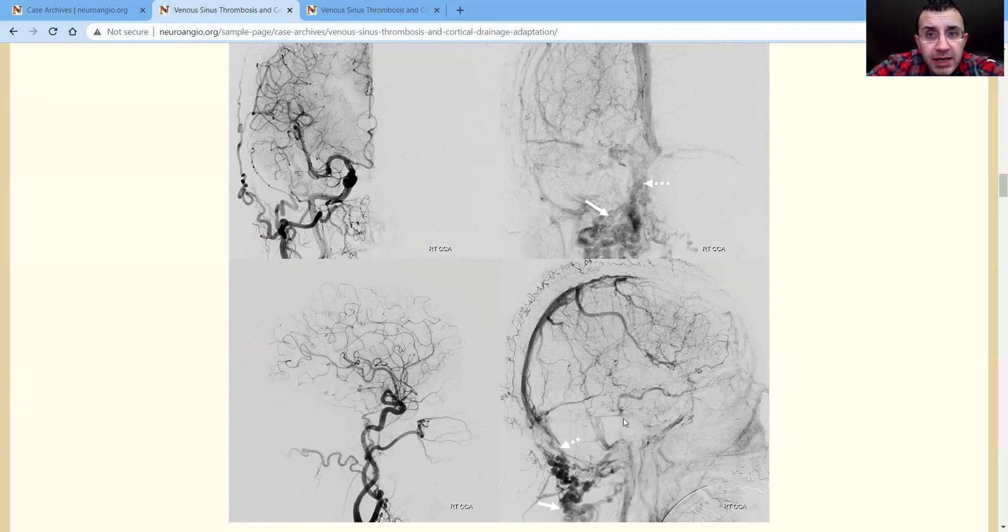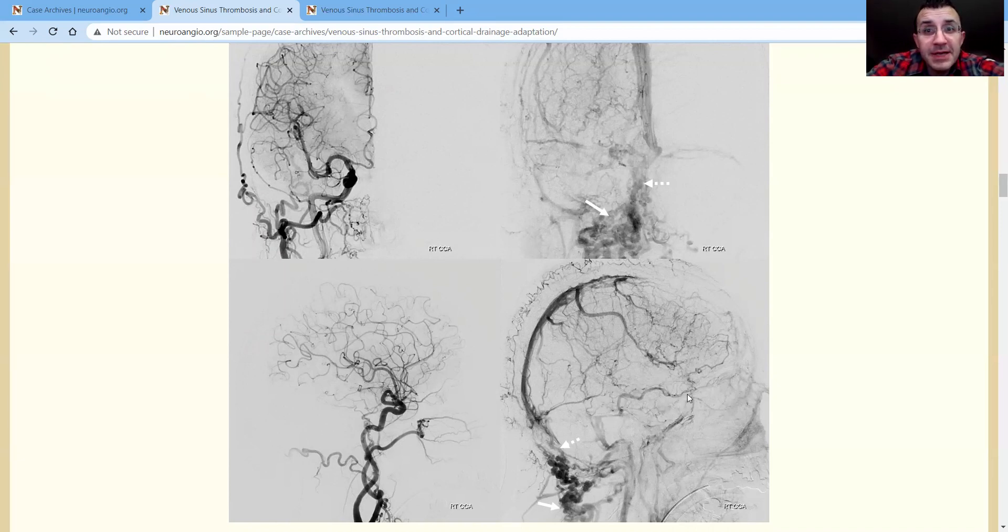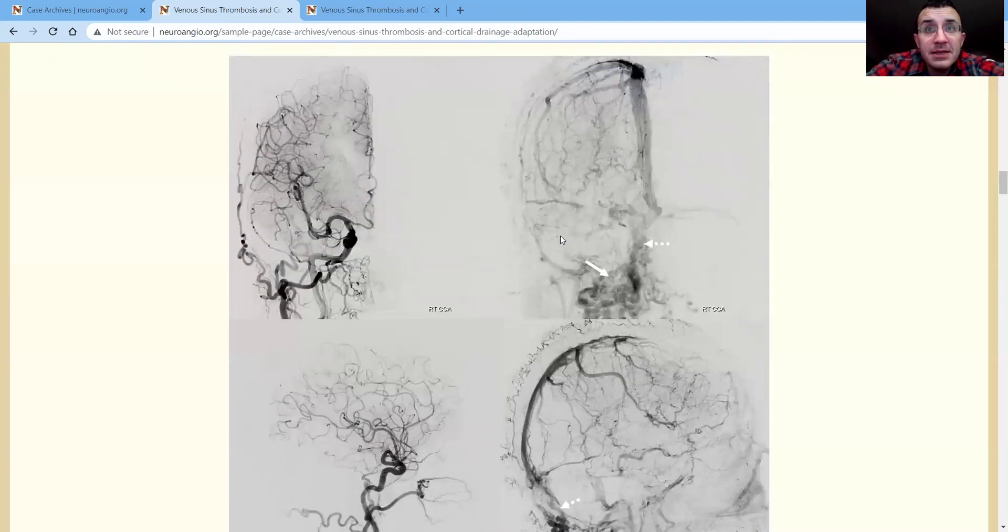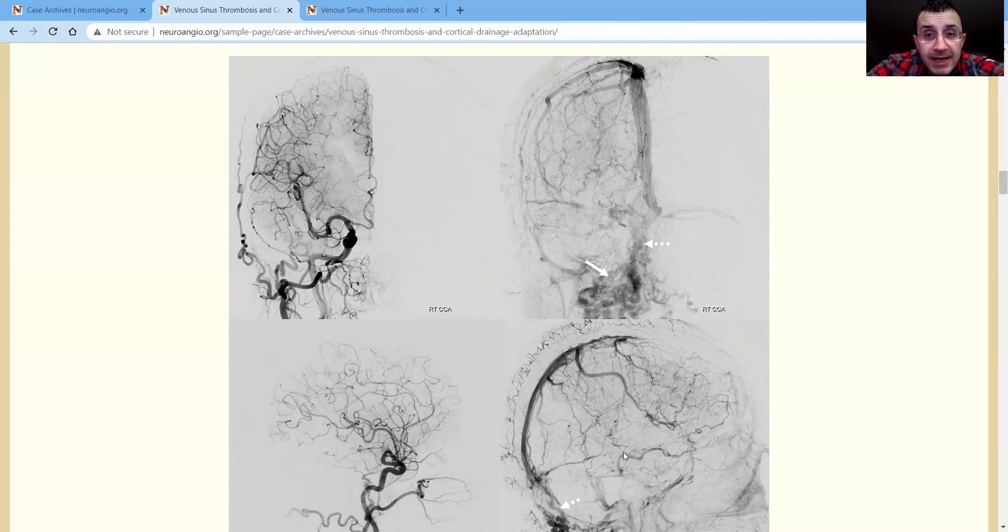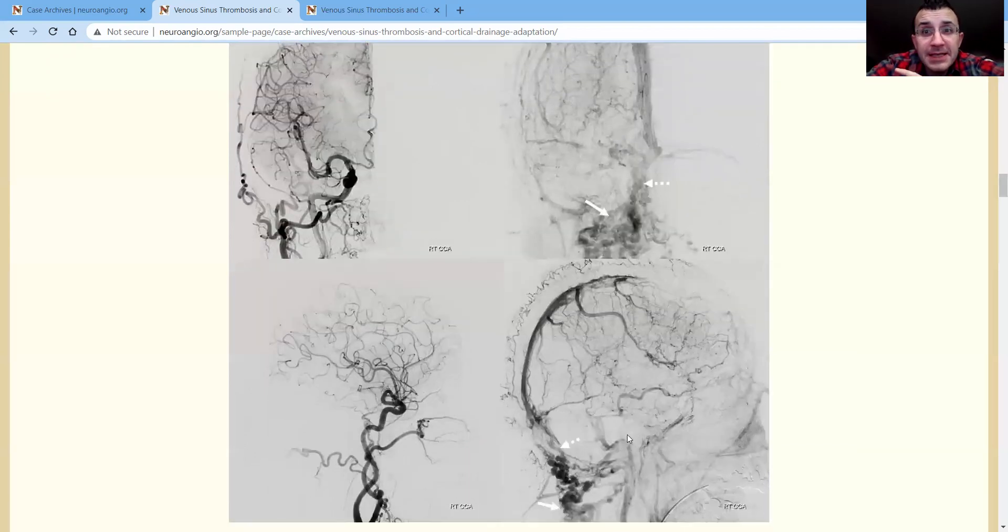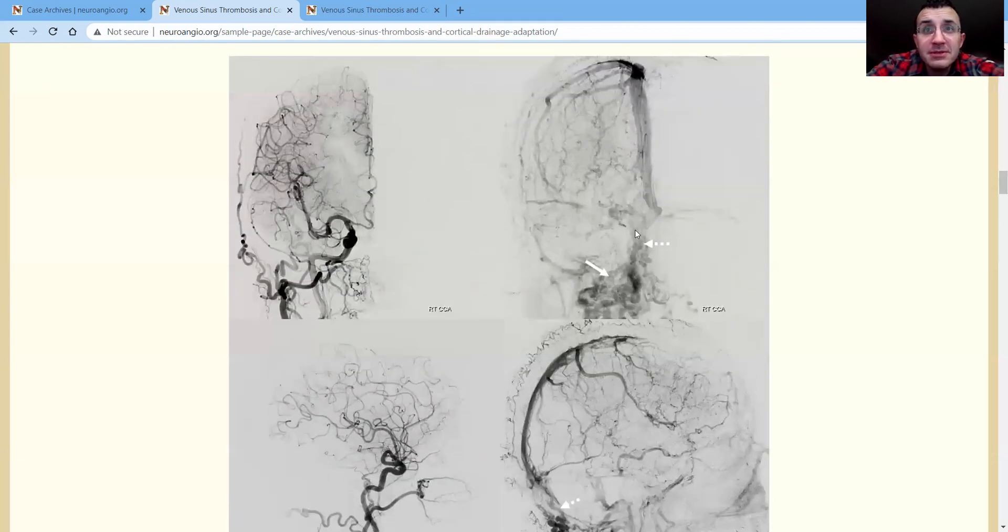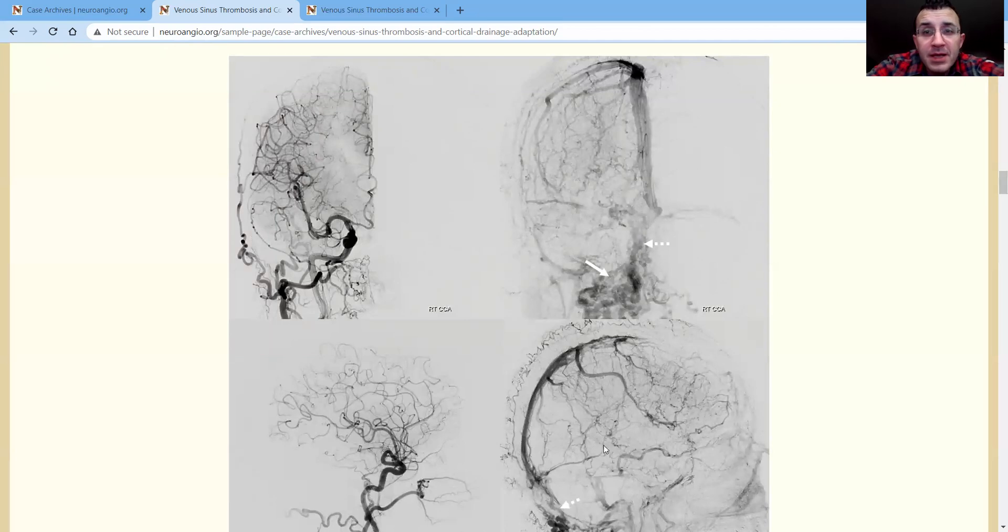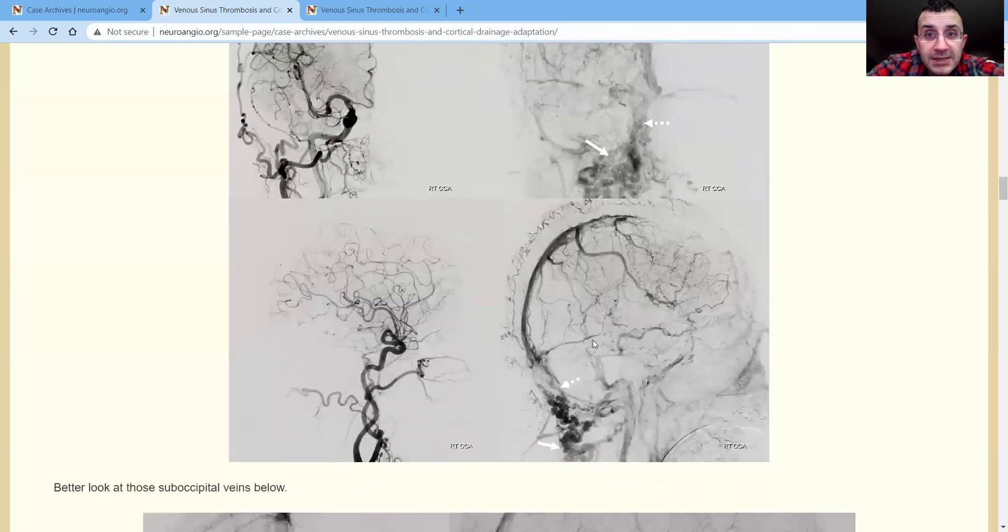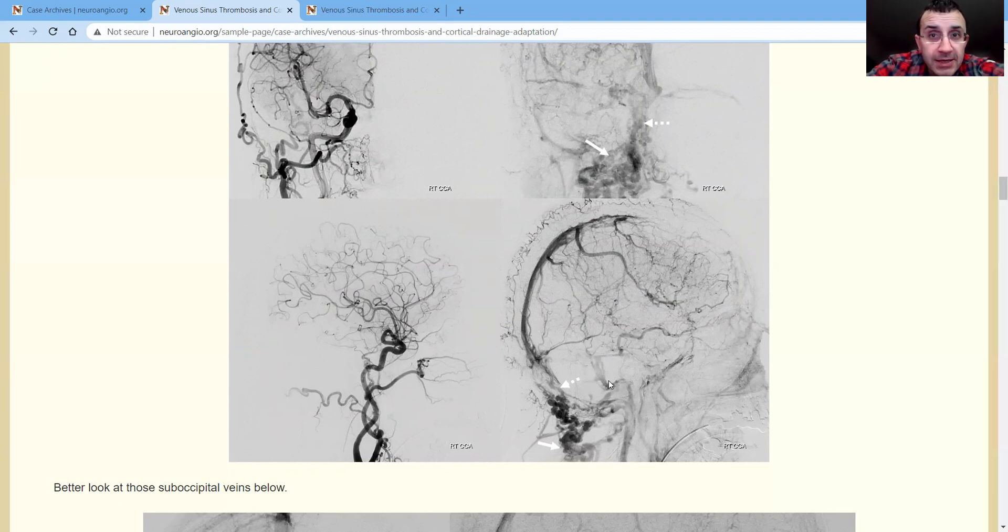Is this the Labbe? No. What is this? Well, you should see the basal vein of Rosenthal page because it's an important finding right here. This is the basal vein. It's the anterior and mid-portion of the basal vein. You can see that right here on the frontal view. And that's connecting via this vein, which I'm not going to tell you what the name of that vein is because please look it up if you don't know. Go to the basal vein page. So there's this connection here with the superior petrosal sinus.